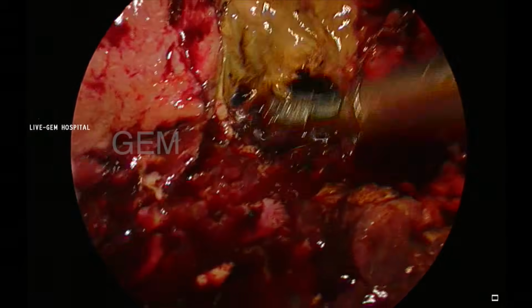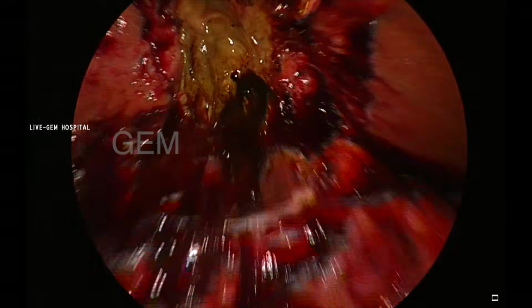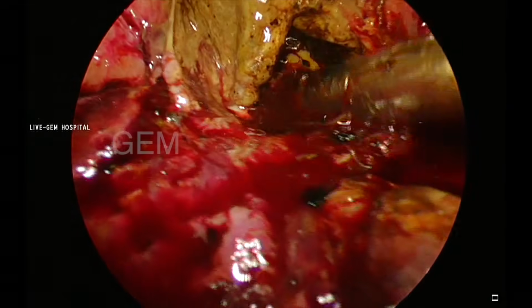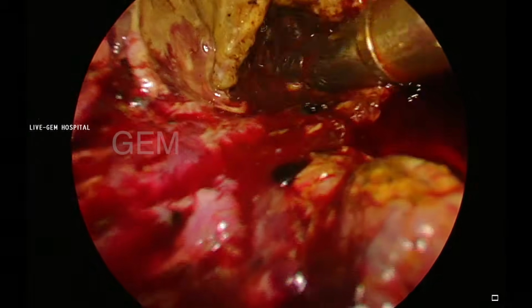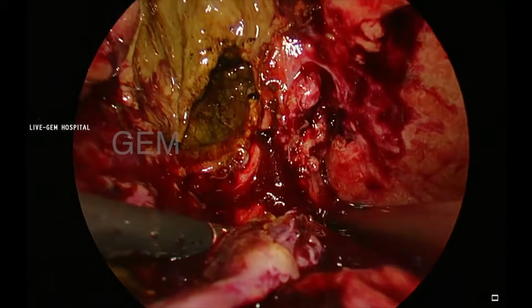So I'm using the stone holding forceps now, 10 mm size, and the suction nozzle, 10 mm. So I am using both alternately. Once the stone is completely taken out, then we can go for the gallbladder dissection.